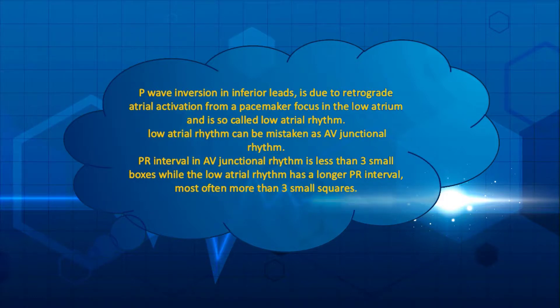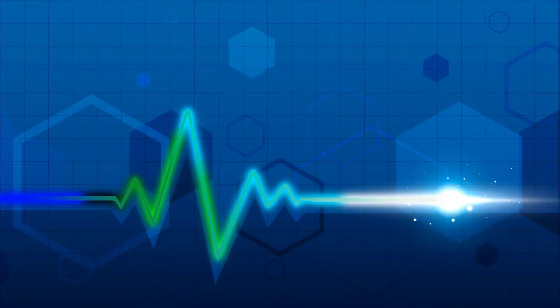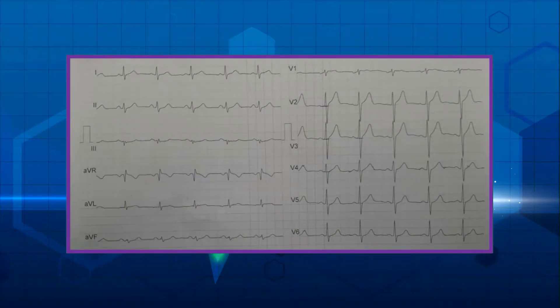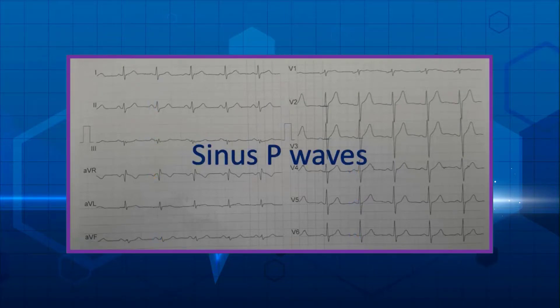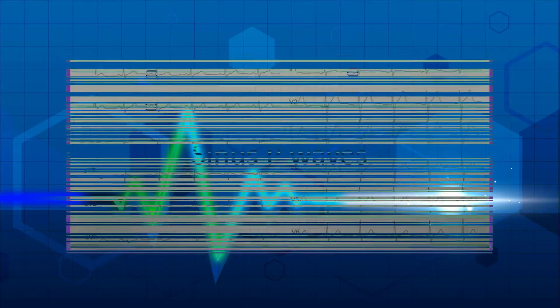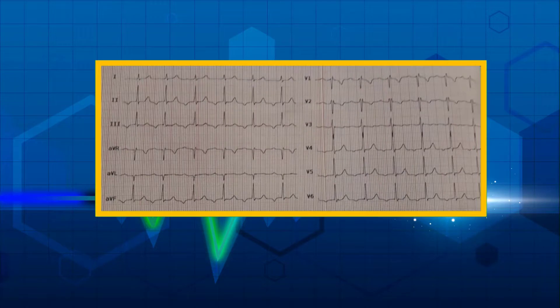Let's go through several examples. In this tracing, the P waves are upright in leads D1, D2, AVF, V3 to V6, and negative in AVR — therefore the P waves are sinus. Note that P wave amplitude in D2 is greater than D1, which is a normal finding in sinus rhythm. The P waves are also biphasic in V1.